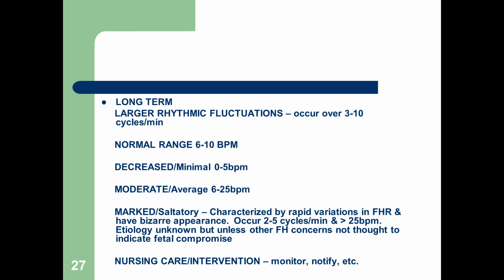If you don't see any variations, like you don't see the sudden increase and decrease, and maybe staying up a little bit and heart rate elevating a little bit and then back to the baseline, you may be seeing a baby in distress, okay?